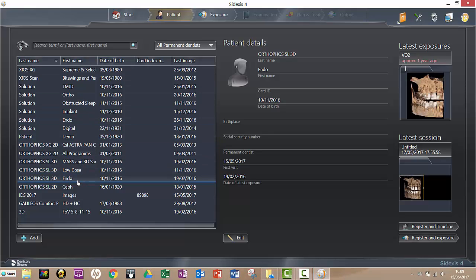Then I go, you see these two here, Register and Timeline or Register and Exposure. Now Register and Exposure is what I would click if I wanted to actually take a new image for this patient, but what I want to do is see the existing images. So I'm going to click here, Register and Timeline.